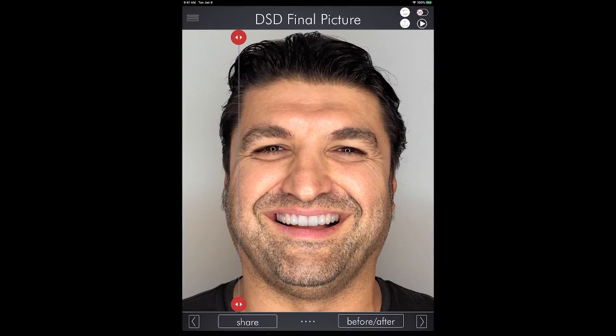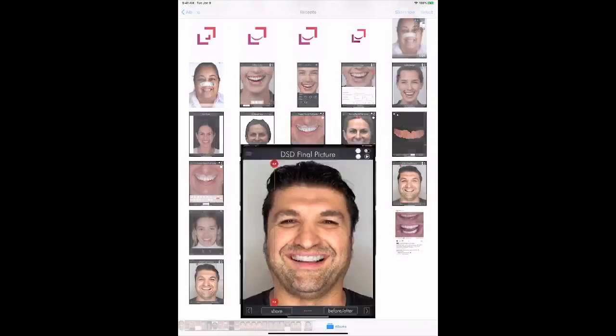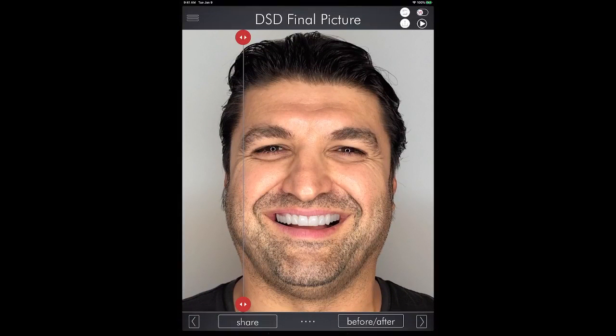We scan all these smile donators and we create the natural templates that we use for them in the design. So we don't have computer-generated shapes. We don't have computer-generated 3D templates that are perfect, that are symmetric, and create a smile that looks like a denture, right? We follow the facial characteristics and we create smiles facial-driven.